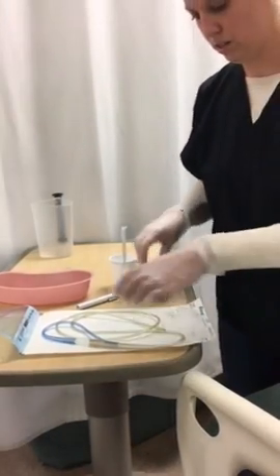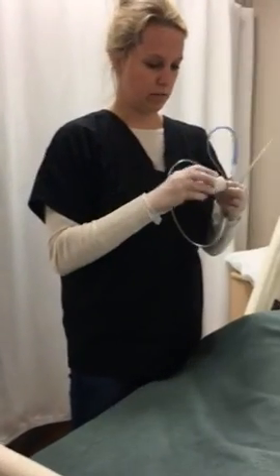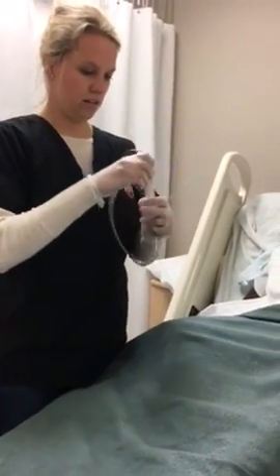Lube. Okay. So now I need to measure the tubing to make sure that I have right placement.